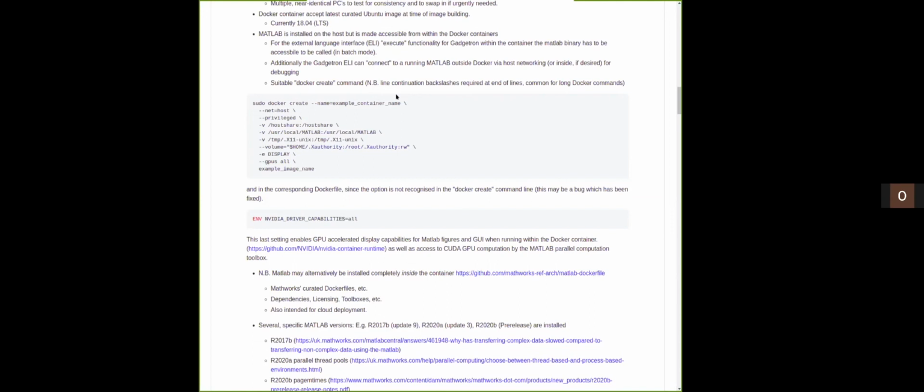And in fact, if you only want to use Connect with the debugging, that wouldn't be appropriate for our neuroscience applications, but would be for developing sequences. Then you can use the host networking of Docker, or even outside of host networking if you wanted to, and have MATLAB running outside the container.